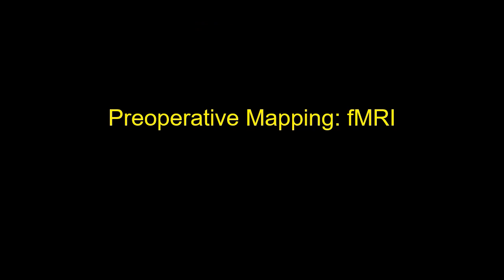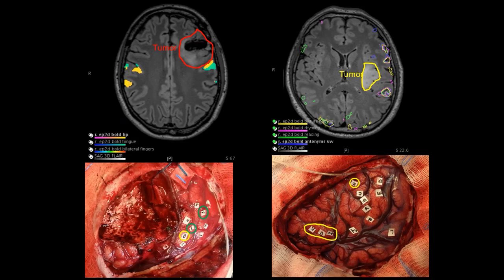Now we'll move on to some examples of functional MRI as it relates to glioma surgery. Here are two examples of patients with low-grade gliomas with preoperative functional MRI and intraoperative direct electrical stimulation based maps.